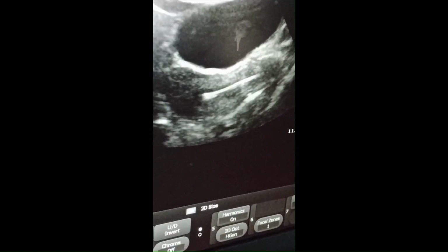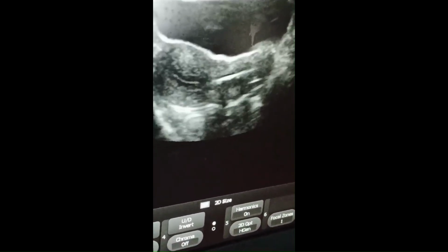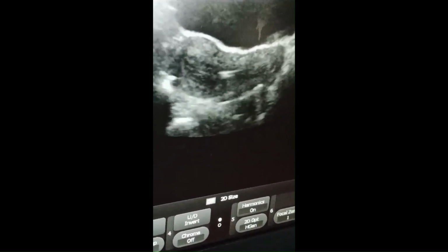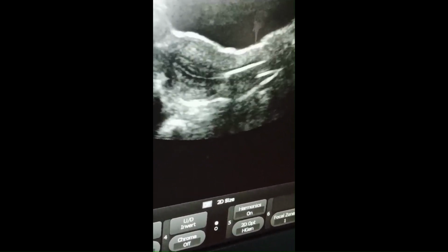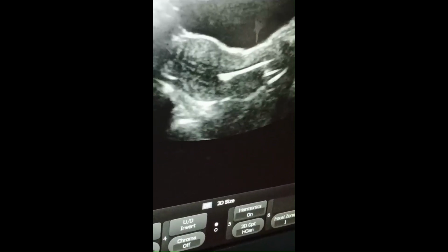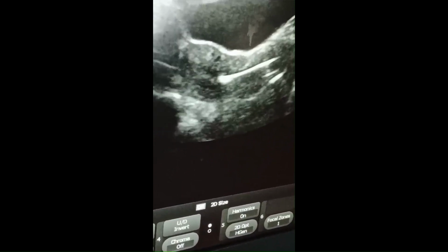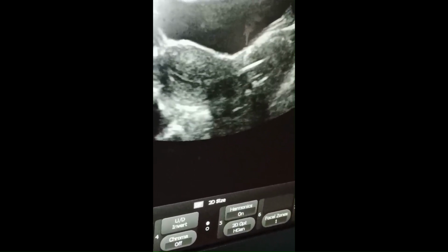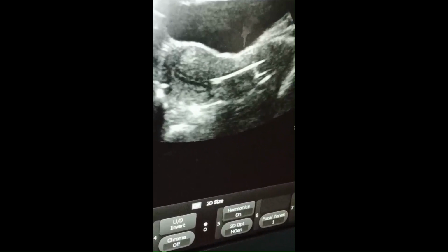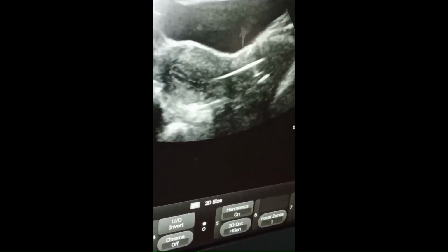Sure Pro Valus embryo transfer catheter is echogenic, so we can see the entire catheter very clearly in ultrasound. As and when we cross the internal os and the catheter tip is seen inside the uterine cavity, gently, taking time, bit by bit, the processed semen sample is pushed into the uterine cavity. Take time to push the sample.